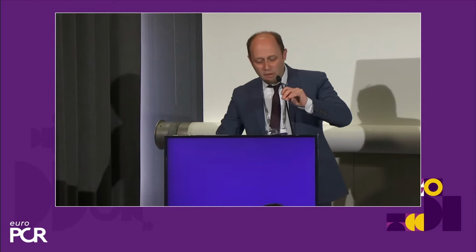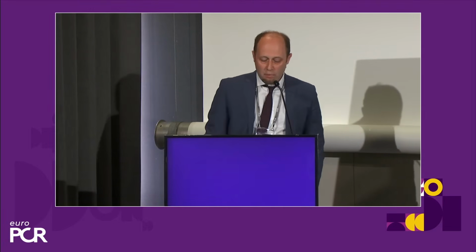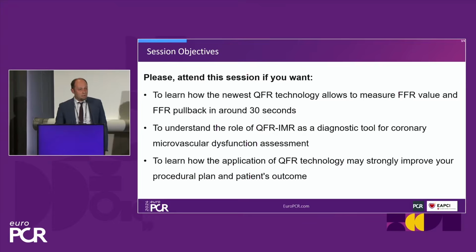Yeah. So just one short slide to show the aim of this session. In particular, to learn how the new generation of QFR technology allows us to measure FFR, not just as a single distal value, but also as FFR pullback in around 30 seconds.